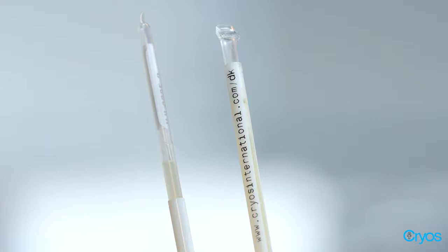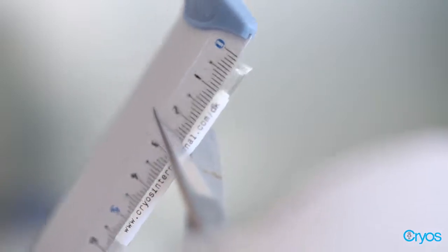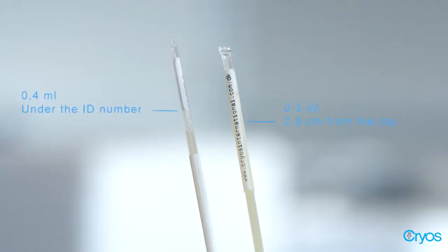At this point, it's important to know what kind of straw you have. If it is a 0.5 milliliter straw, cut the straw 2.5 centimeters from the top of the straw. This is on the other end of the straw that's still closed. If you have the 0.4 milliliter straw or IMV straw, cut just below the plug, under the ID number.